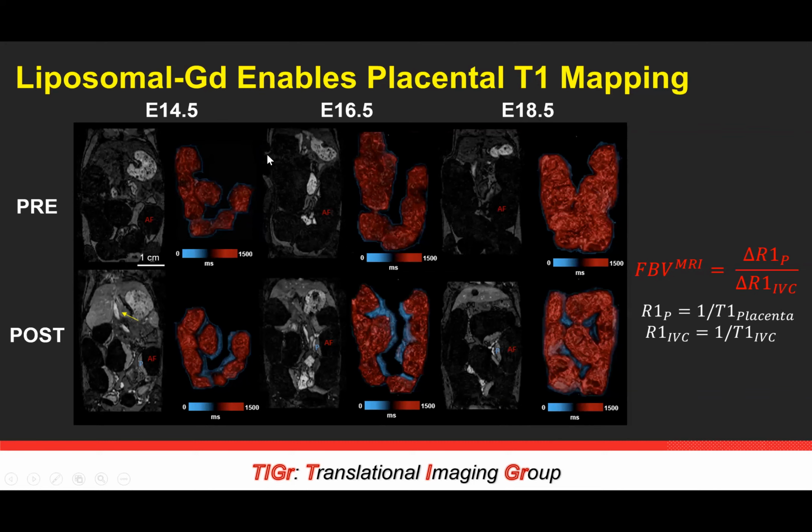I've made volume renderings of the T1 values that we've calculated for the uterine tract here. You can see the different FPUs and see a relatively low amount of relatively homogeneous signal between the different fetal placental units. Also notice there's a little bit of a band here on the edges, which is somewhat artifactual just as a result of the volume rendering.